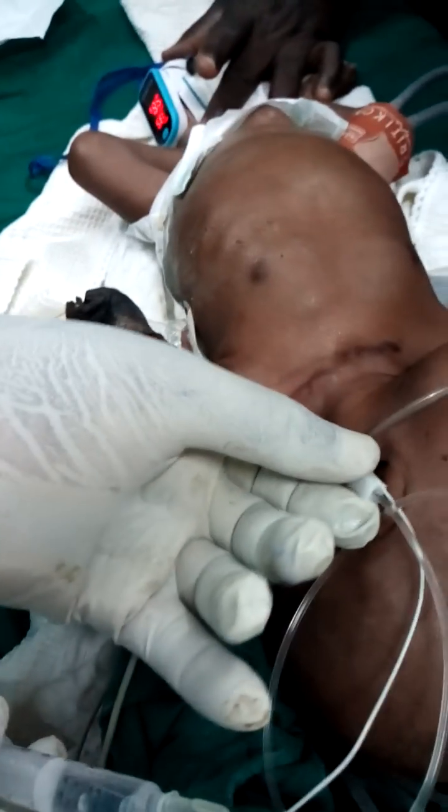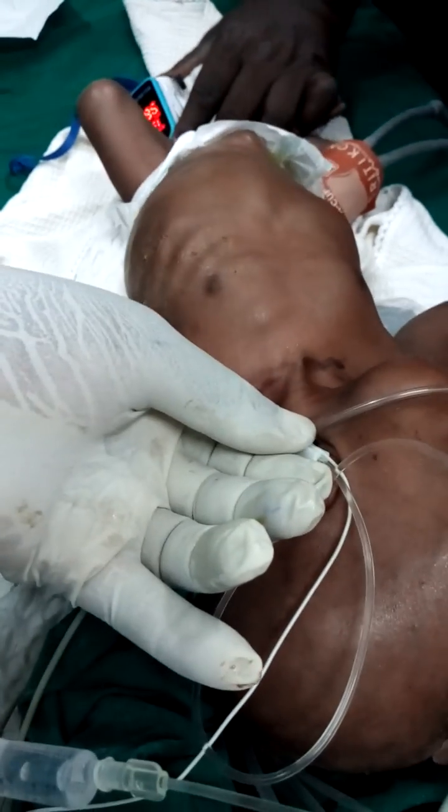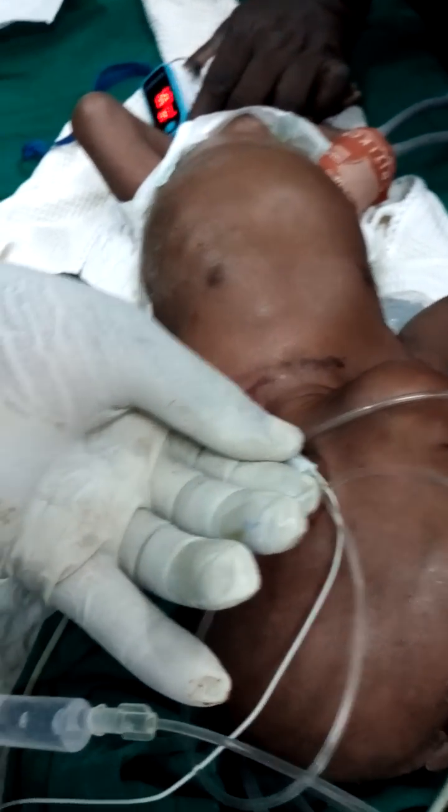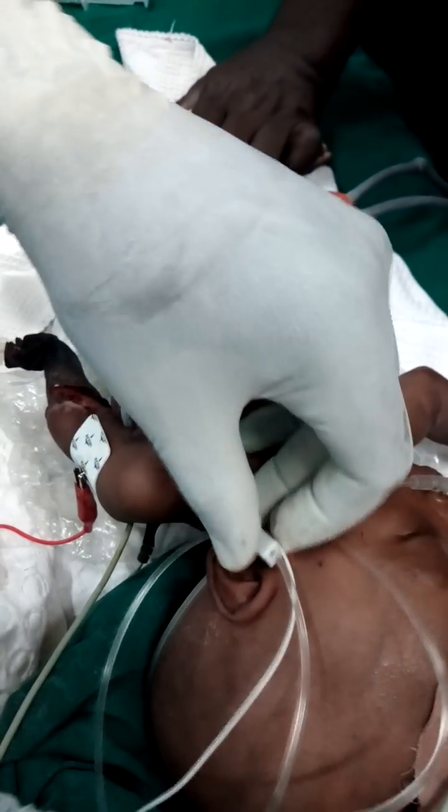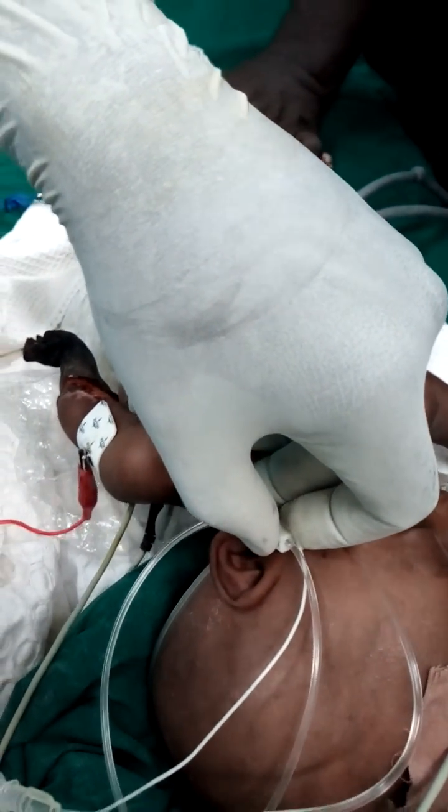I'm going a bit too deep. Remember, you have to adequately sedate the child before you commence the procedure.